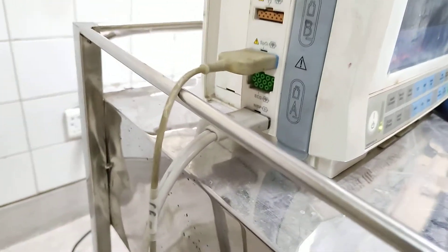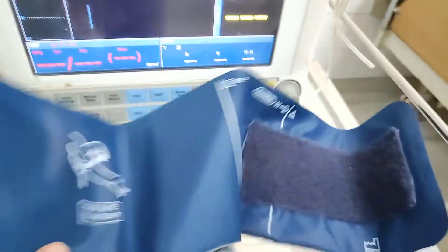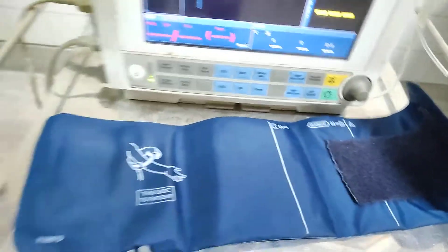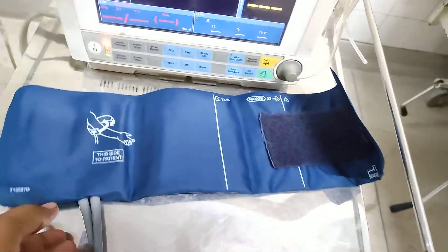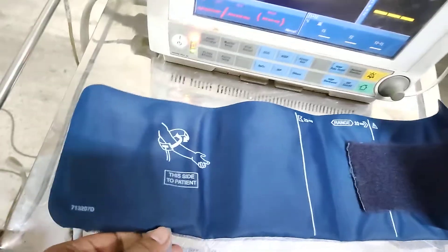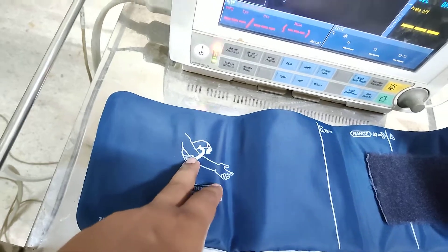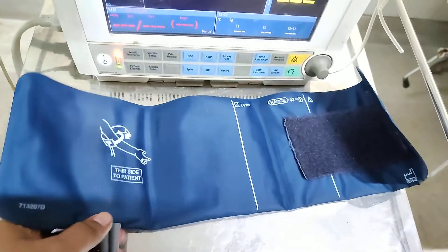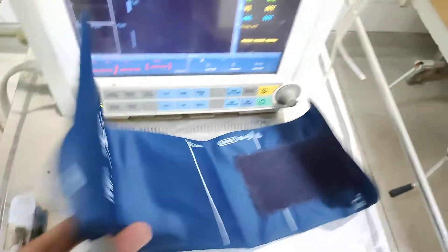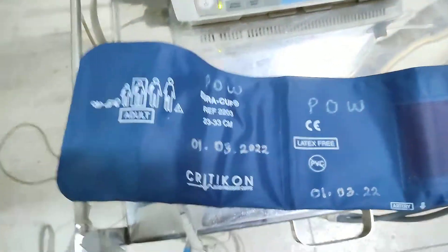There is a NIBP. This is the normal BP cuff. You can check the patient's blood pressure back to normal BP after the patient.